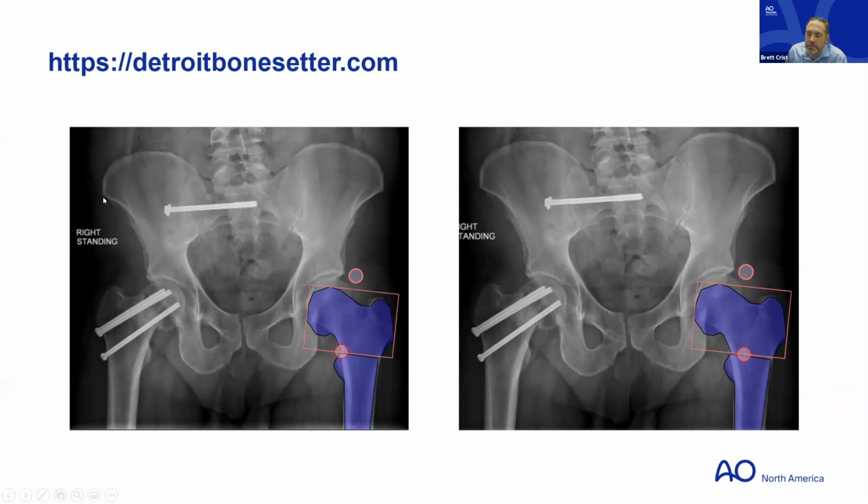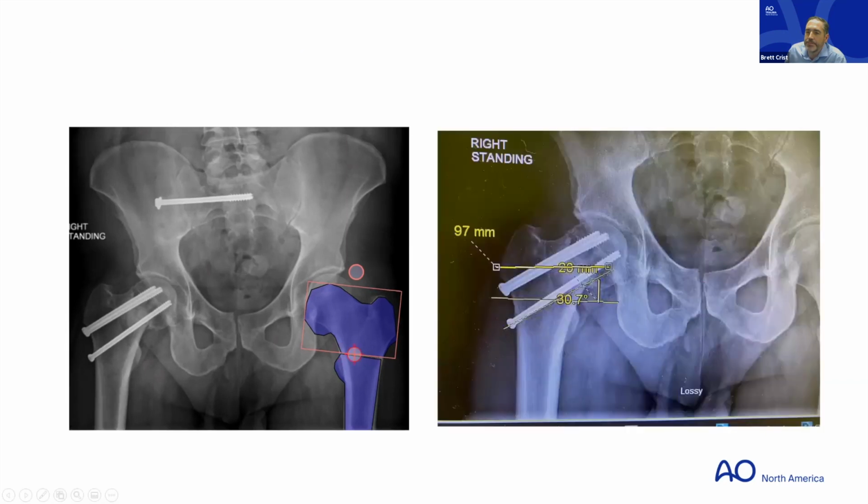I just flipped it, and instead of isolating it to a hip, I wanted to show both sides. So basically the purple is the right side flipped to match the uninjured side. And then the crosshair mark is where the rotation point of the osteotomy could be. So if you have it totally on the medial side exit point versus a third of the way towards the lateral cortex to try to give a more leg length change.